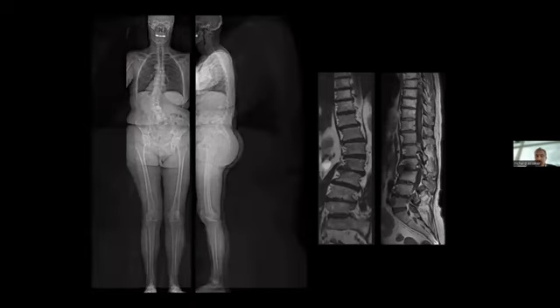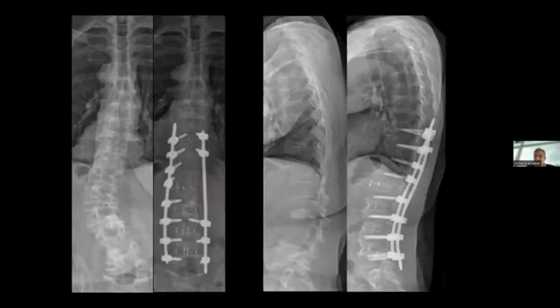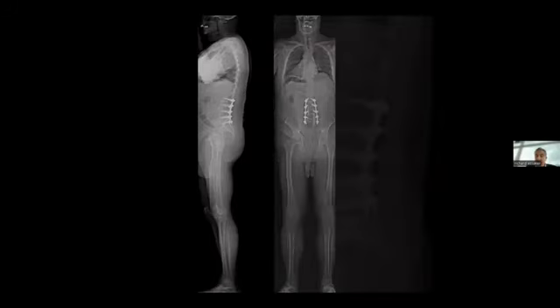Deformity correction with minimally invasive surgery is also an option. Here is a case where anterior realignment was done first and posterior fixation second, realigning the patient with a combined approach. This is another example where I performed one-stage anterior cages and posterior percutaneous fixation — a typical minimally invasive long-segment fusion.